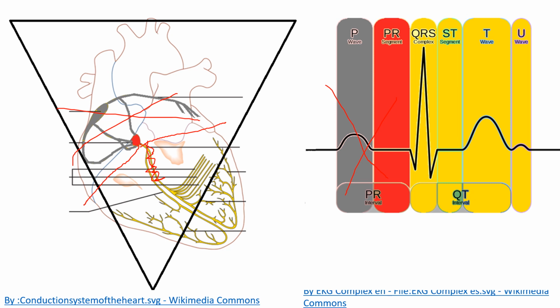Every time I start here, I'm going to produce a different QRS than when I start here. But it's going to look exactly the same as it did last time I started here. Because I'm not starting where people are used to, we're going to call that bizarre because it's going to look different.